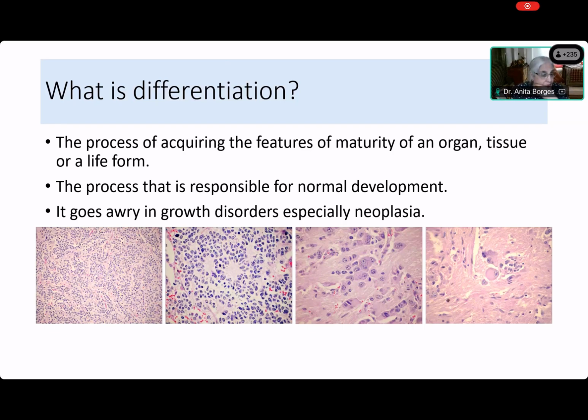Now, let's start at the bottom. Sneha, are you there? Yes, ma'am. All right. You see these pictures over here? You've been looking at them for a long time. Can you tell me what these pictures represent? I'm asking you, you're a PG3, right? Yes, ma'am. So tell me, what are these pictures, starting from the left and going to the right? Do you recognize these pictures at all?